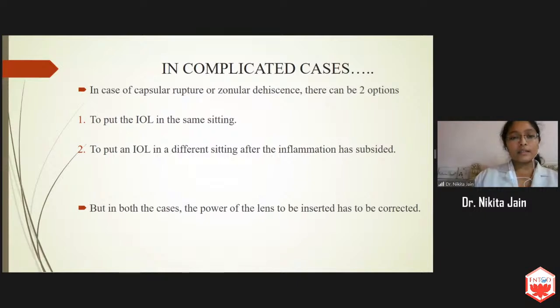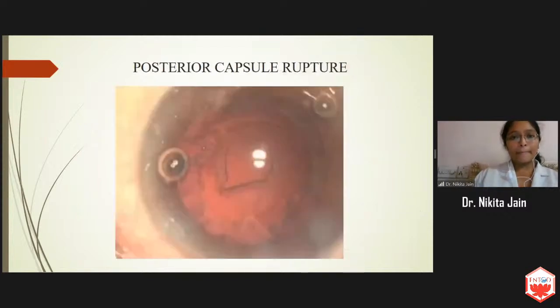In complicated cases, like in case of capsular rupture or zonular dehiscence, which can occur very commonly in pseudoexfoliation, there can be two options: to put the IOL in the same sitting or to put the IOL in a different sitting after the inflammation has subsided. But in both cases, the power of the lens to be inserted should be corrected accordingly. This is a case of posterior capsular rupture.